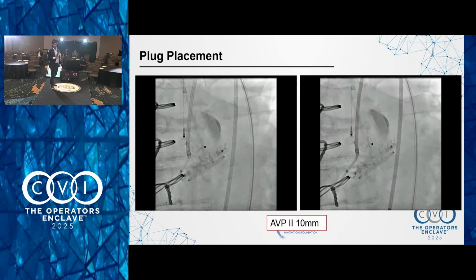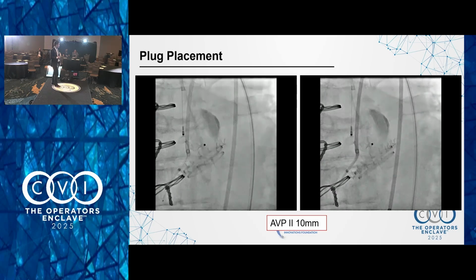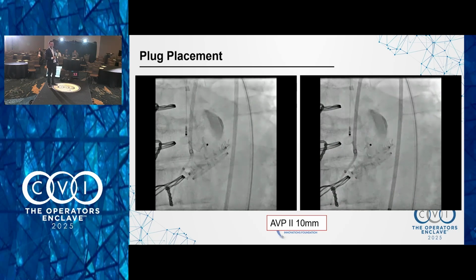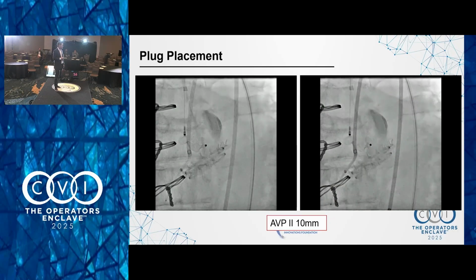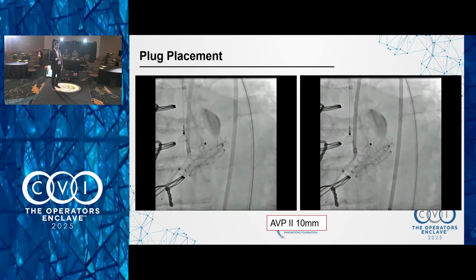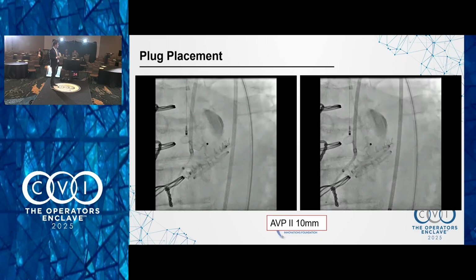You deploy it? Deploy what? The stent, the RCA stent. Right. Yeah. Okay, 100%. Very nice. So what if you pull back your guide and just have your guide extension in and you're still filling? False sense of security for me. Thoughts?